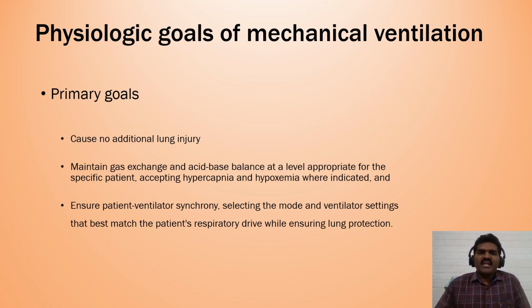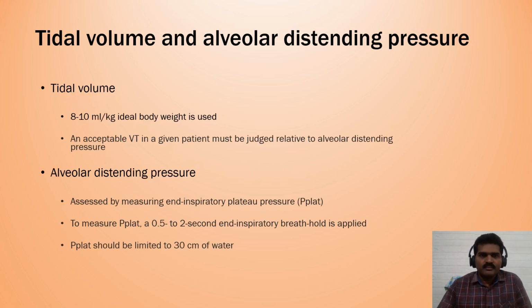If the patient and ventilator are not in synchrony, the patient is giving his own breaths, the ventilator machine is giving its own breaths, you cannot achieve the goals. So selecting a mode and ventilator settings that best match the patient's respiratory drive while ensuring lung protection and obtaining the maximal patient ventilator synchrony are your goals in mechanical ventilation.